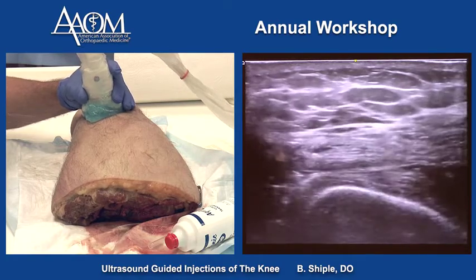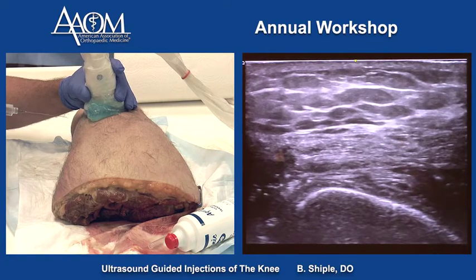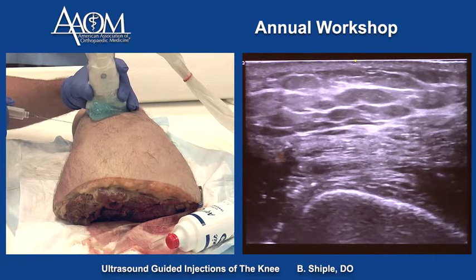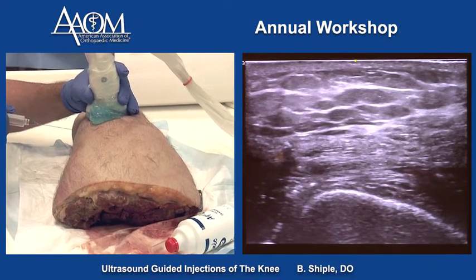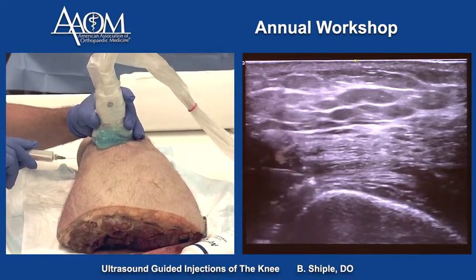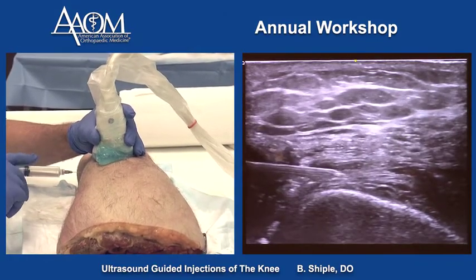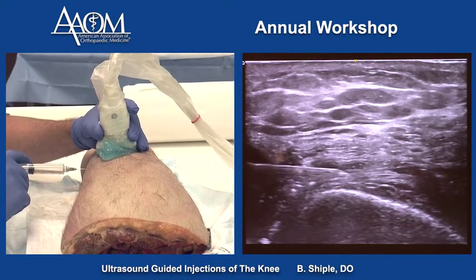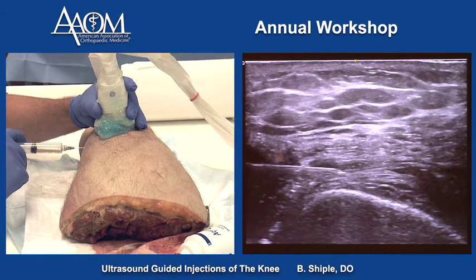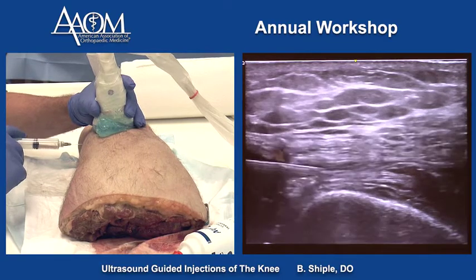We're going to travel down. To get the needle at the level underneath the quadriceps tendon, I need to slide down the side of the knee about two centimeters for needle entry. We're going to advance the needle, and it looks like it's in the joint space right there. Let's see if we get a little puff of fluid — and I'm injecting.